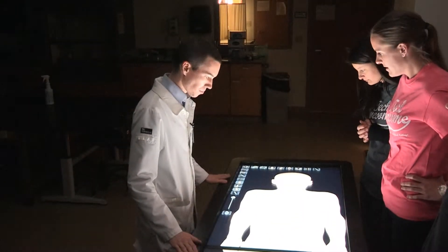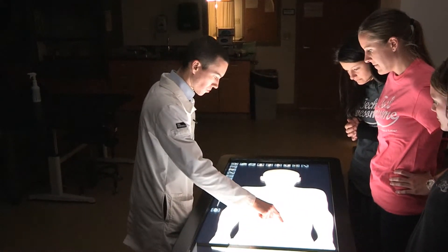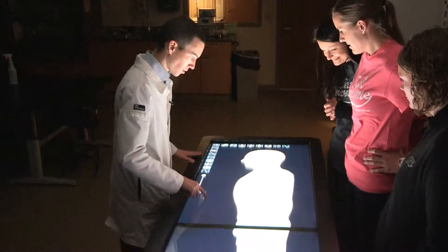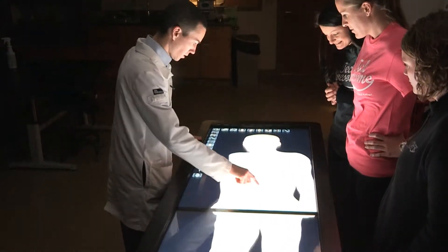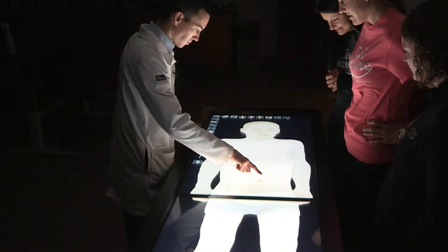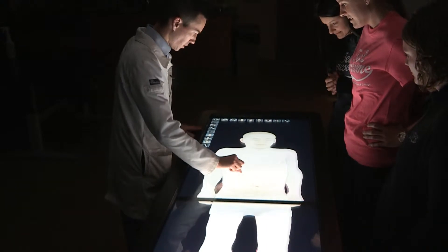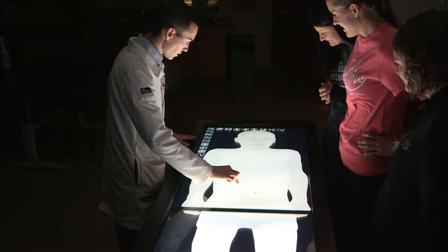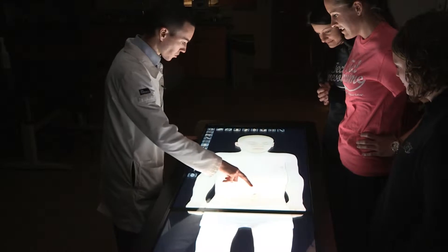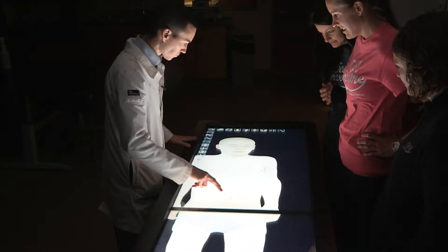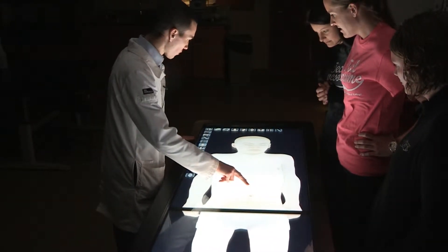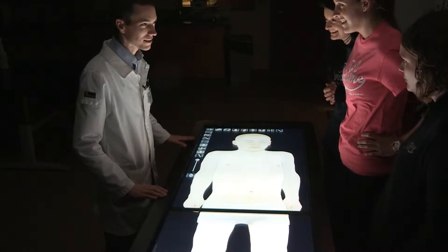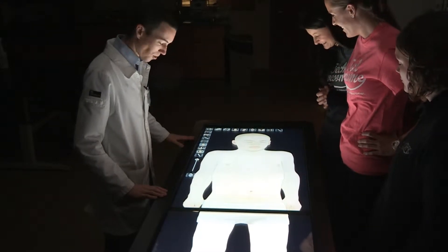We can operate it very much like an iPad. If you use one finger like this, you can rotate the human body. You can do this with two fingers — do the pinch and go out like this. We can also pan. I find that most sixth graders figure out how to use the table in like two seconds. They're all over it.